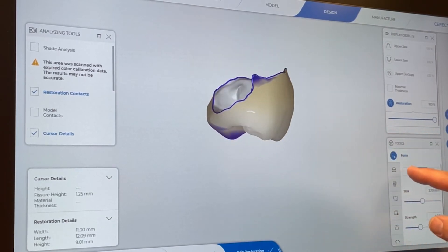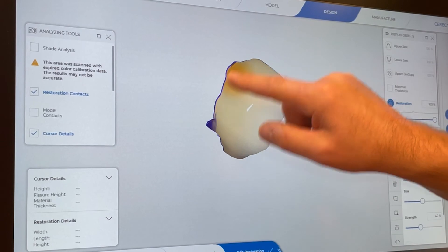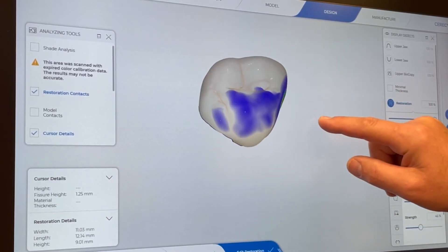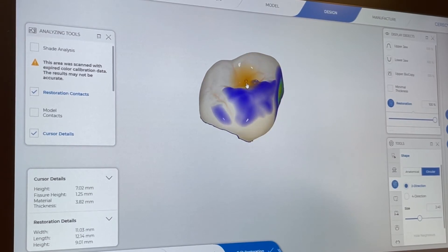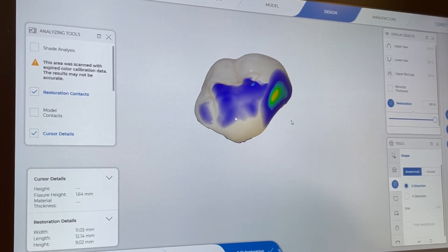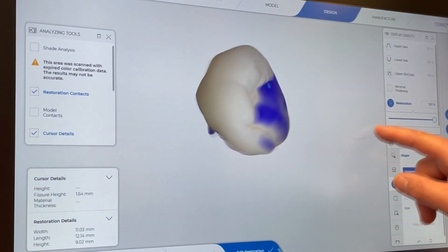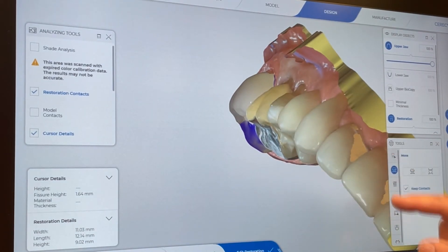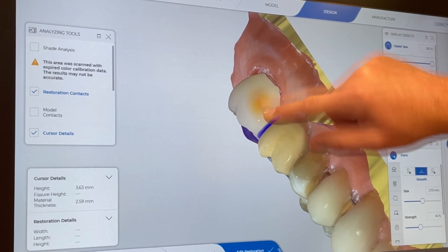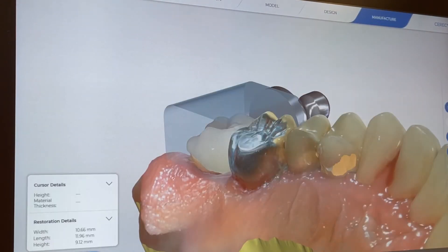Checking everywhere and doing fine tuning — I'm adding a little bit where it might be thin at the margin. Looking at the full arch to see if anything is overly bulky to smooth out. I noticed I was a little thin on the fissure height so I went back to the shape tool and brought up the fissure height — now at 1.64mm, which is reasonable for a Tessera crown. The buccal looks a little bulky so I go back to the form tool and smooth that buccal face down. Now we're happy and ready to look at sprue position.